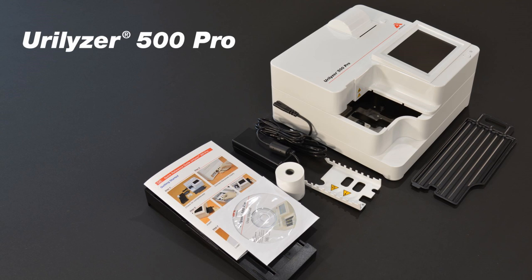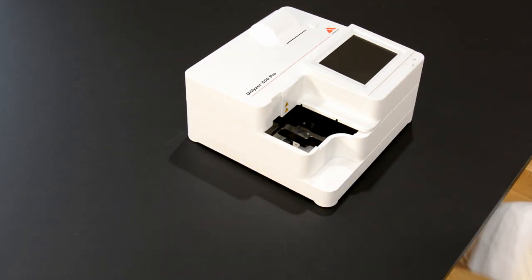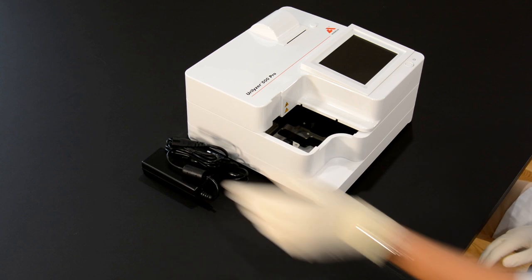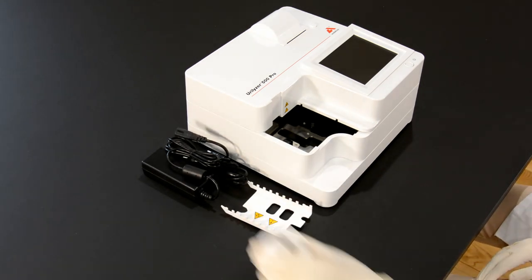The Urilyzer 500 Pro is a semi-automated urine test strip analyzer of the latest generation. The high throughput of up to 500 tests per hour in combination with state-of-the-art operator and data management functions provides the ideal system for mid-sized to bigger laboratories and for hospitals.